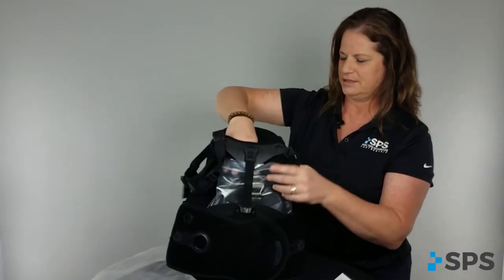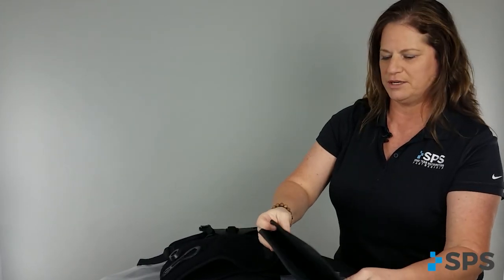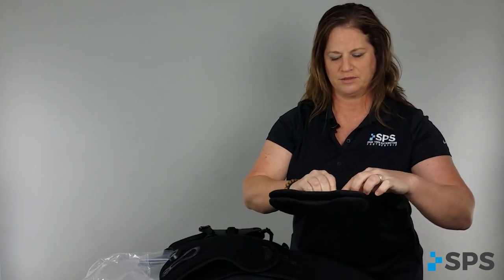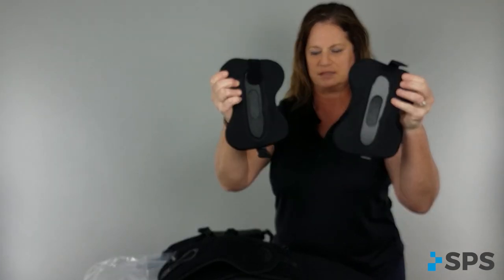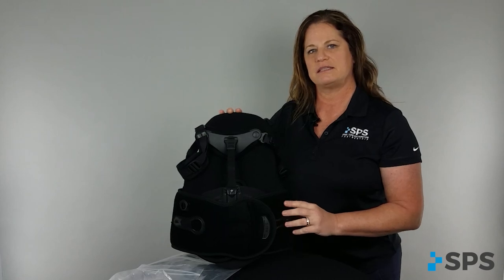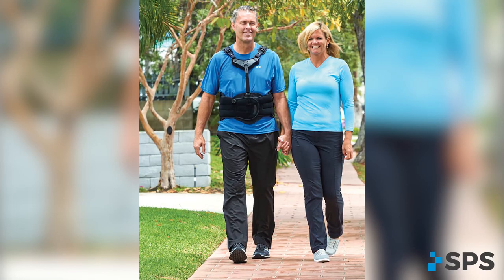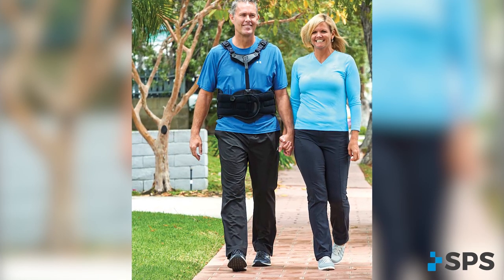Also inside, you'll find the Sleek Max TLSO plus two additional panels and two lateral panels. These lateral panels have openings on the sides. The Sleek Max TLSO is a very unique device because it comes as a universal device that can be custom fitted to the patient.